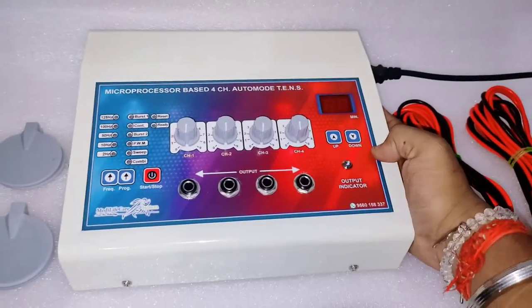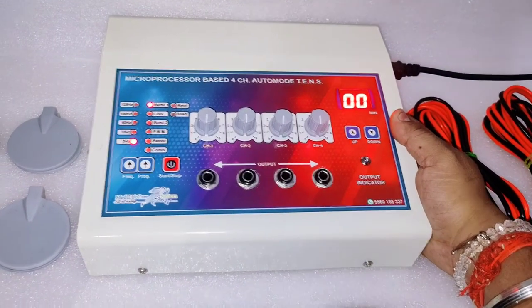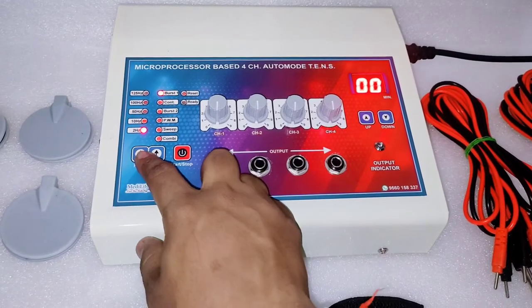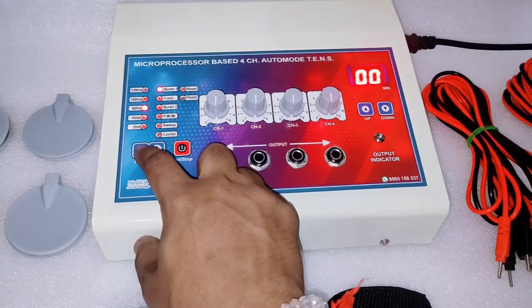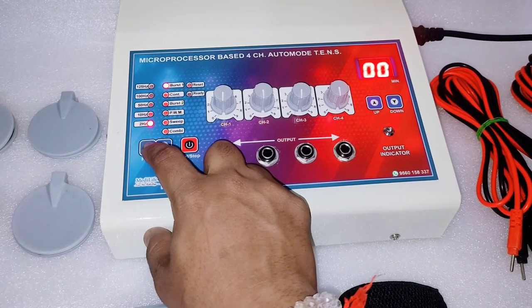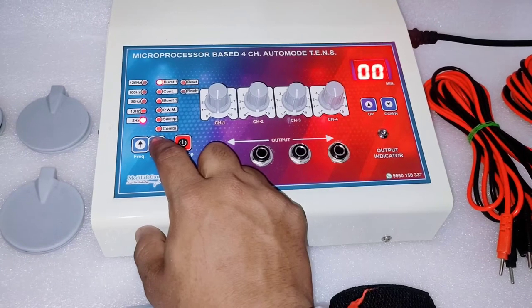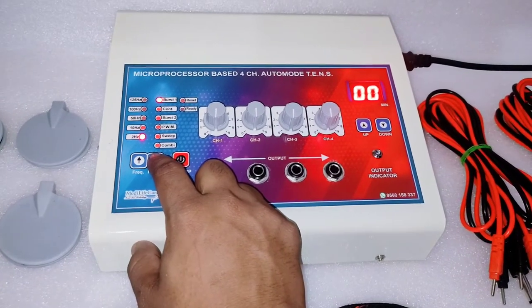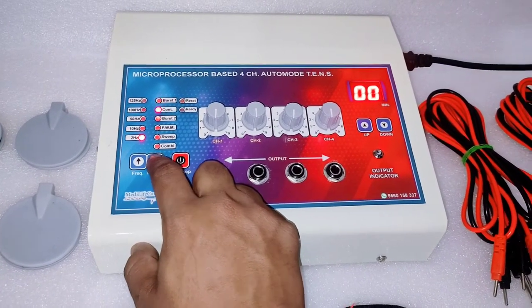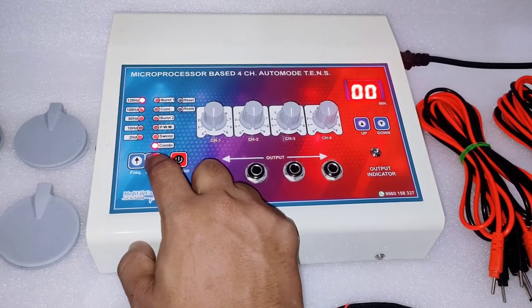On the right side there is a power button. Simply press it and the machine will start. On the left side of the machine there is a frequency button. These are the frequencies: 2 hertz, 10 hertz, 50 hertz, 100 and 125 hertz. 6 programs, as I told you: Burst 1, continuous, Burst 2, PWM, sweep and combi.